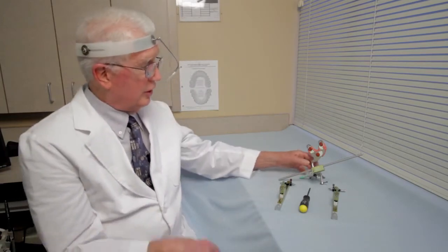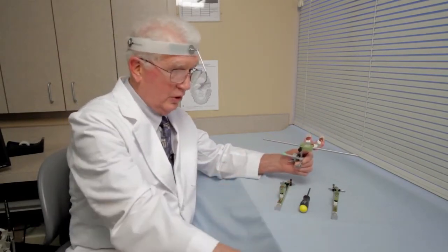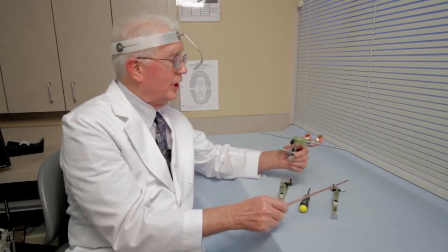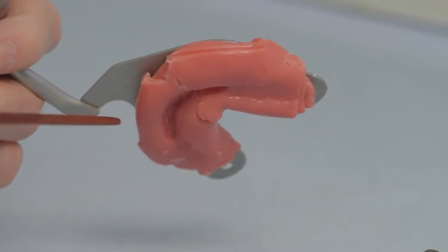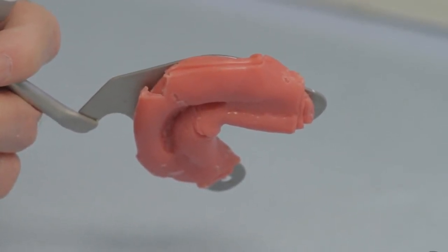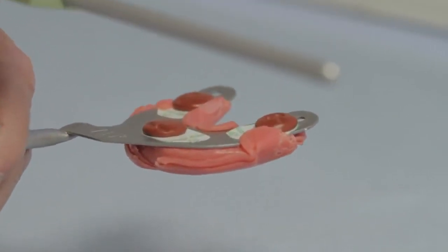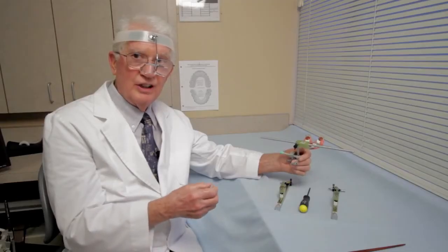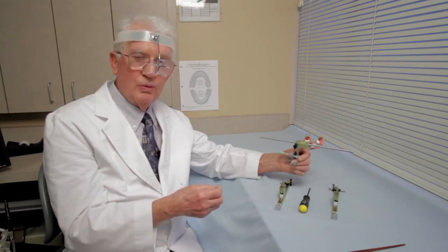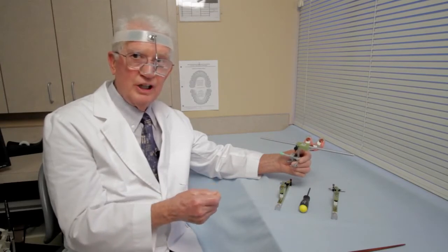I think it's important that you understand exactly what happened when we took the ear bow, or the estimated facebow, and why we did some of the steps that we did. Number one, you remember that when I did the bite fork, I had the patient hold the bite fork in place by placing pink wax on the bottom of the bite fork and closing the patient into the pink wax. The important part of that is that as the patient was closed into the pink wax, I manipulated the mandible so that I placed the condyles in centric, so that when the patient closed on the pink wax, the patient was holding the bite fork against the upper teeth with the condyles seated in centric relation. That's a very, very important step.